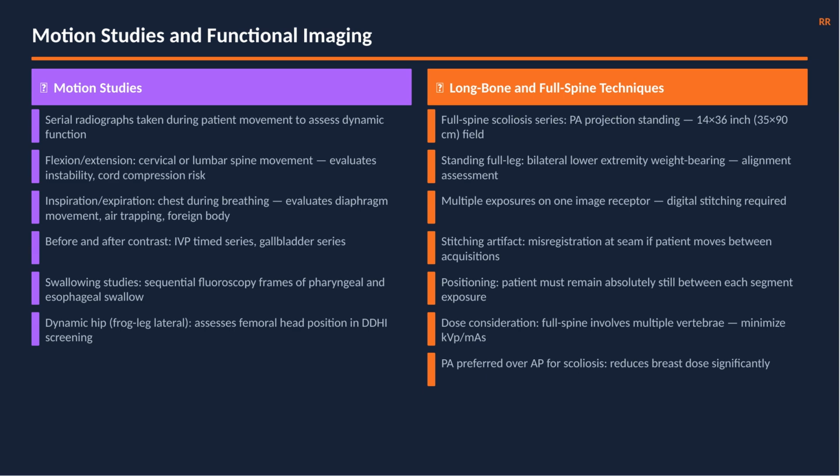Inspiration and expiration chest series. Evaluates diaphragm excursion, air trapping, or foreign body detection. A foreign body may be visible only on one phase of respiration. Swallowing studies. Sequential fluoroscopic frames documenting pharyngeal and esophageal swallow mechanics.